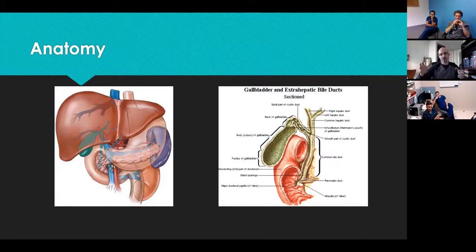Fanning through, just quickly look at obvious pathologies, especially for the ICU purposes, if there's any abscess or signs of malignancy, that sort of thing. Having a look at the venous pattern and the biliary pattern and the bile ducts and all of that. Then we have the gallbladder and the common bile duct and the portal vein.